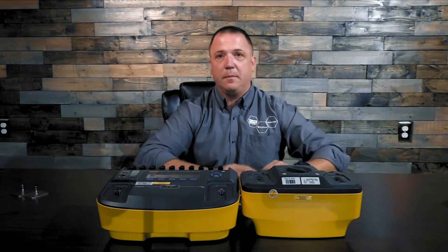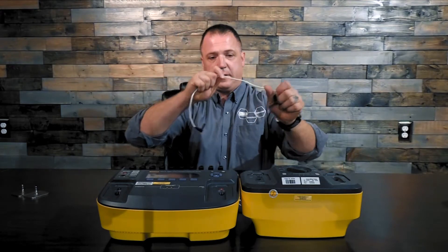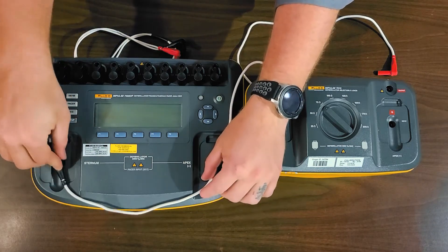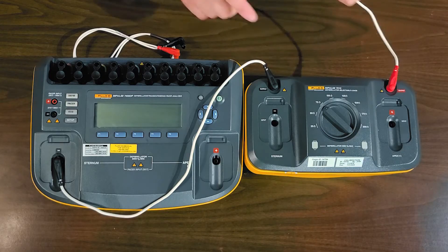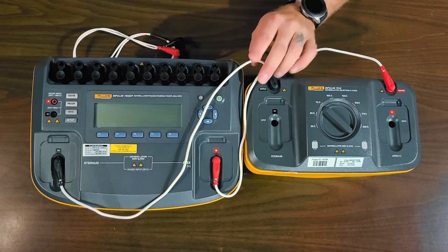Now the setup — this is how easy this is. I'm going to take the black lead that came with the 7010 and go to the black output, over here to the black sternum input of the Impulse 7000. Then we take the red output over here to the red input of the Impulse 7000.